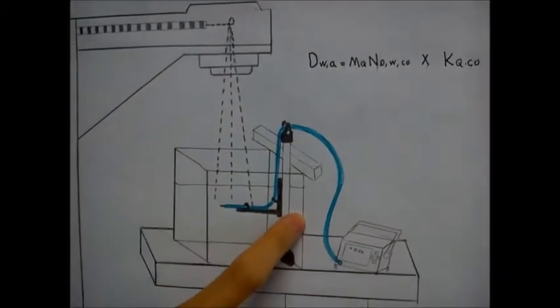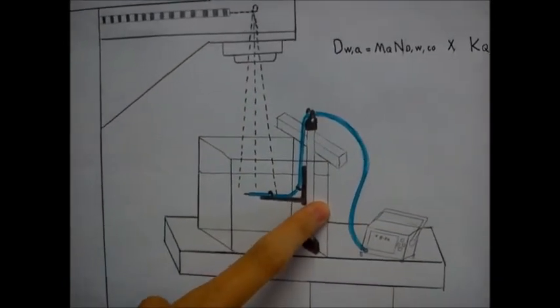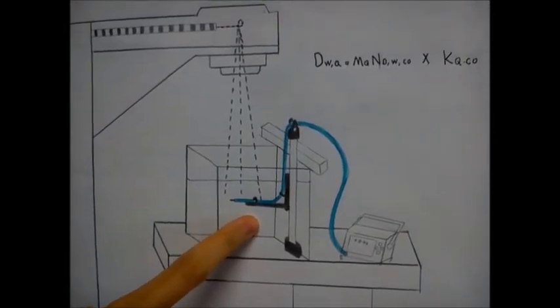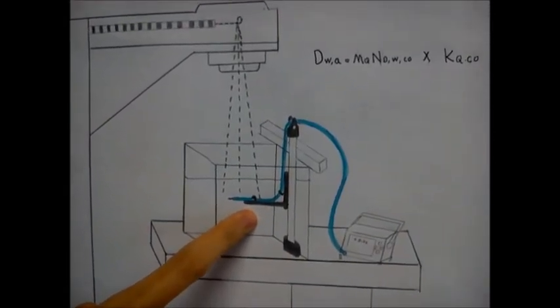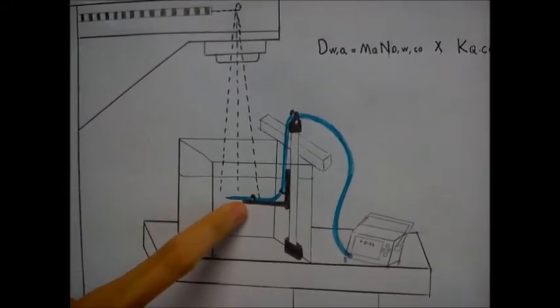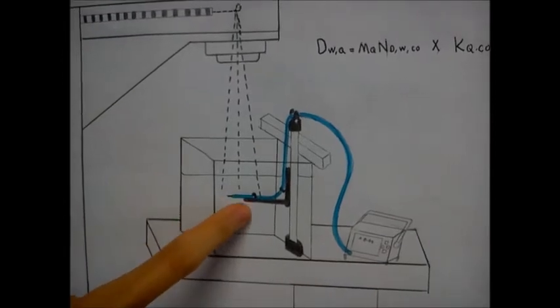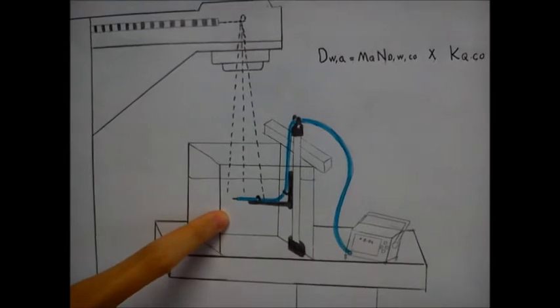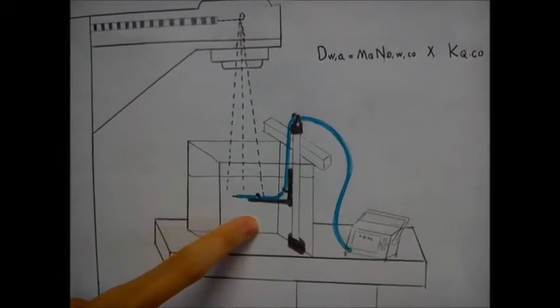During the calibration, we use an ionization chamber. There are two types of ionization chamber: cylindrical and parallel. Usually in a water phantom we use the cylindrical type. The cylindrical ionization chamber is used at a given depth, typically 10 cm, placed in the water phantom.